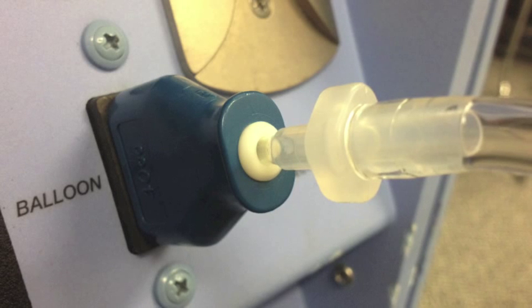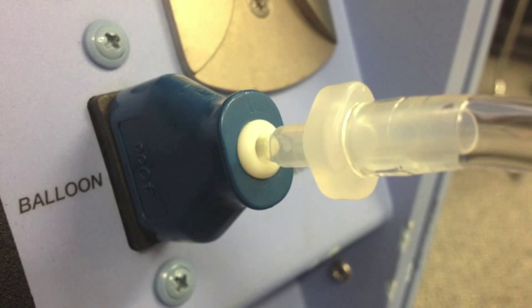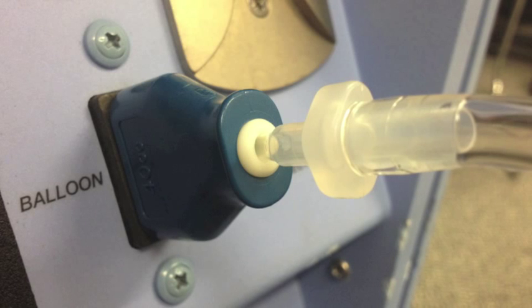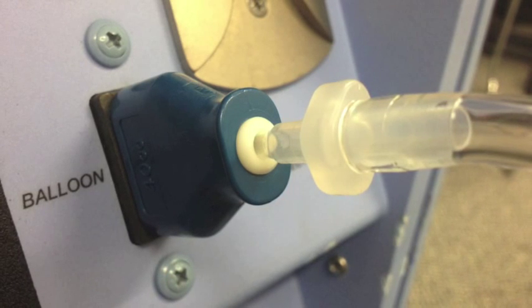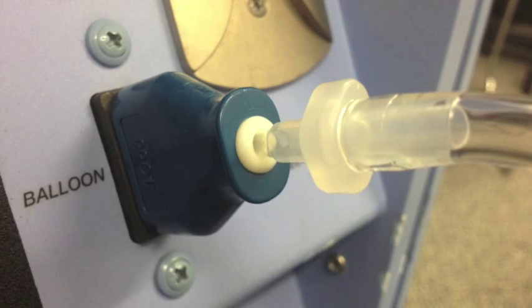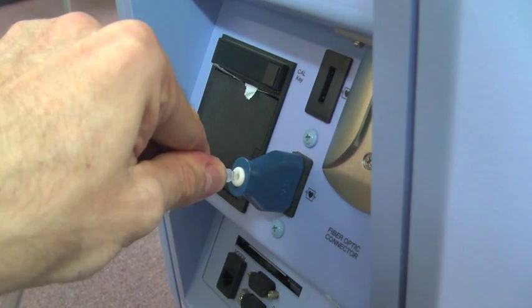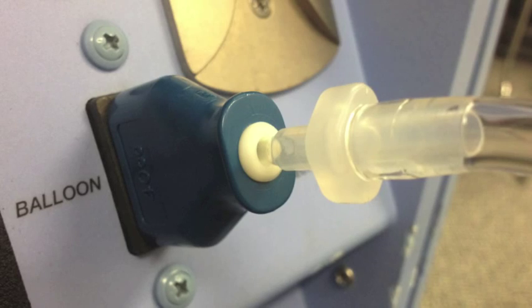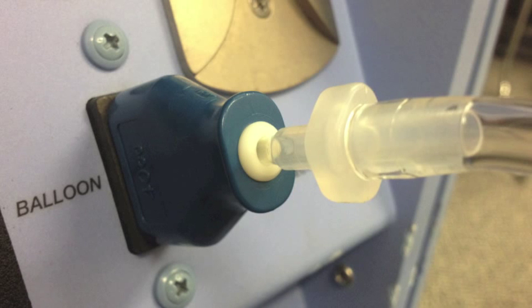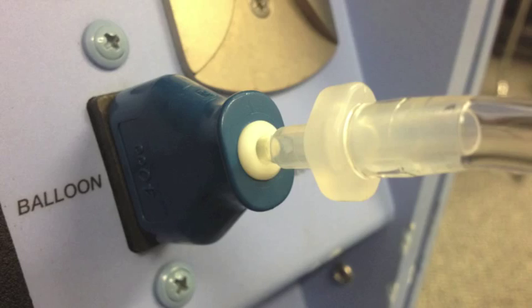With regard to transferring between different types of pump, clearly going from Arrow to Arrow does not pose a problem. If moving from a Datascope pump onto our Arrow machine, a number of the blue connectors shown in the photograph are kept in the blue bag attached to the side of the pump. And it's clear from the photograph that the Datascope connector easily fits into the back of this. This arrangement will allow easy transfer onto the balloon pump at the receiving facility, whether it is Arrow or Datascope.